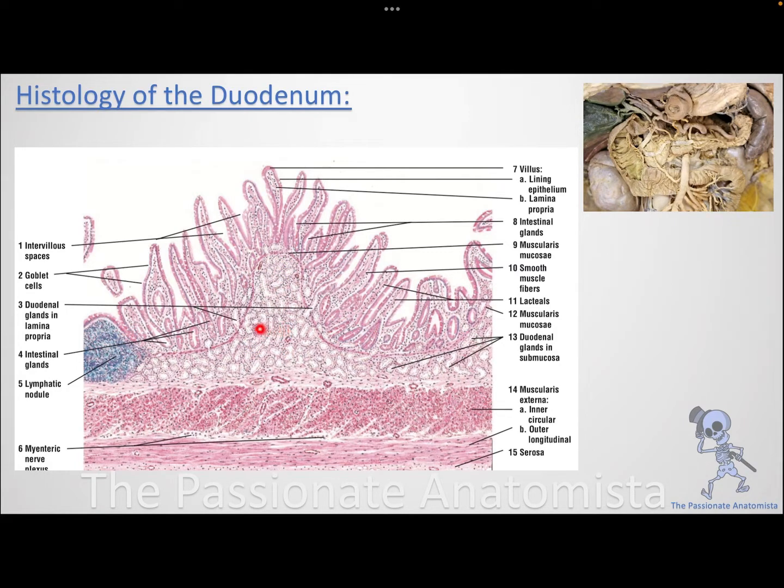And then you have another kind of adaptation, which is when the mucosa itself folds to give you the villi. It means now you are in the small intestine. The core of your villi is lamina propria, because remember, the villi are mucosal folds. But the plica circularis are submucosal folds, so your core is going to be submucosa. And of course, you have the muscularis and serosa.